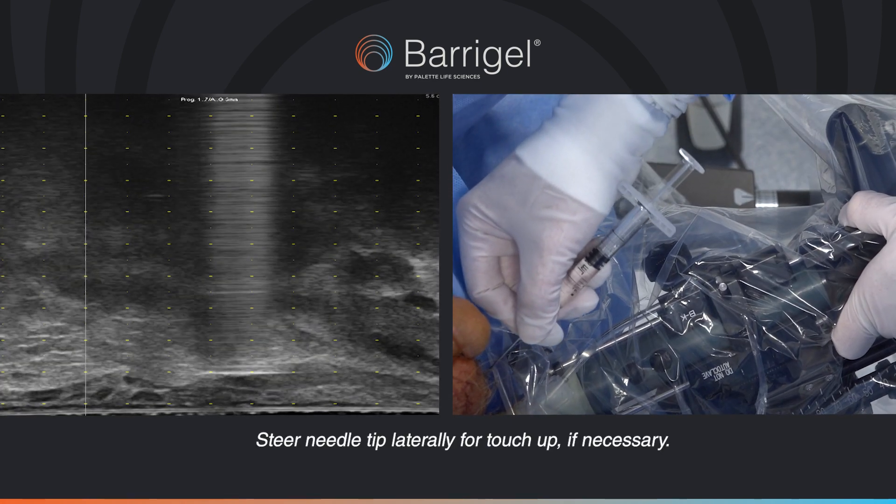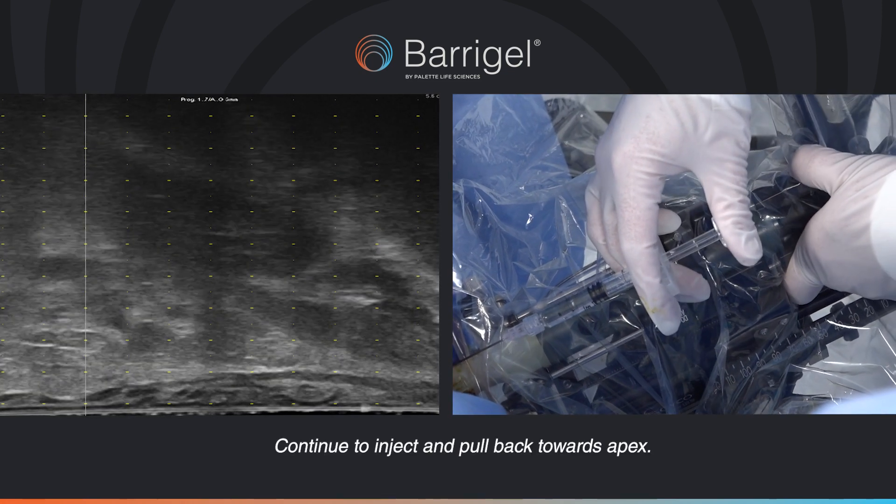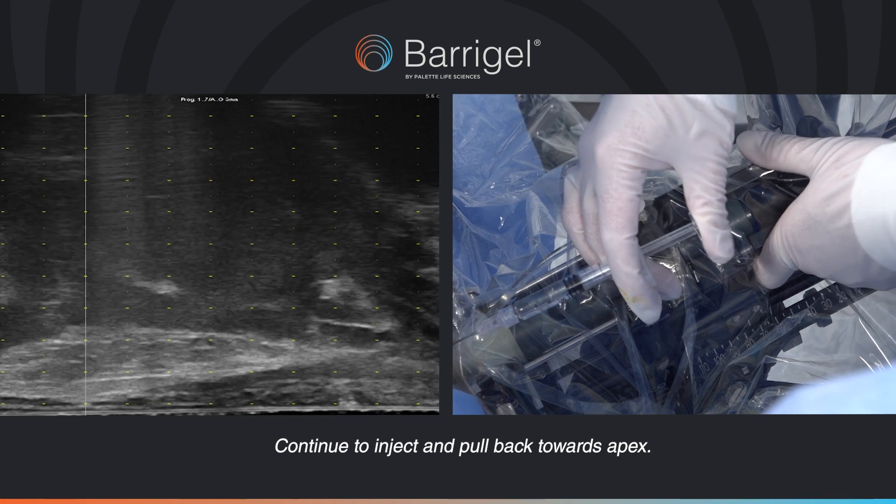Steer the needle tip laterally for touch-up if necessary. Continue to inject and pull back towards the apex.